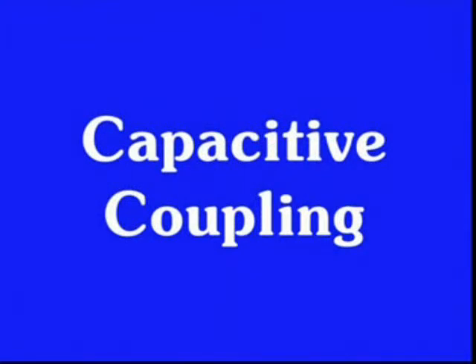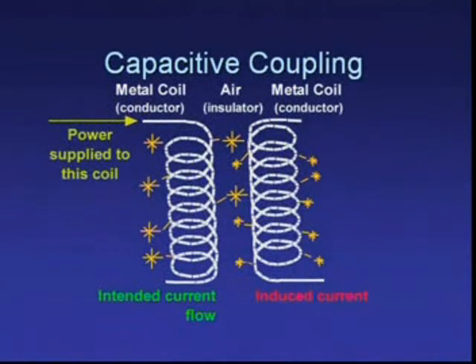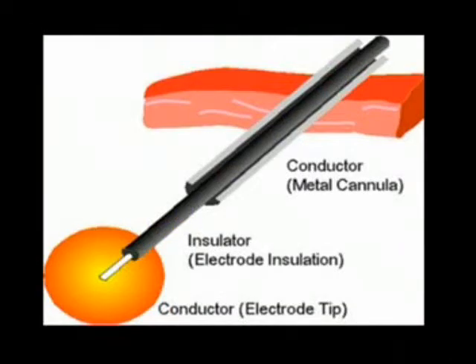Capacitive coupling. To understand this hazard, it is worth revisiting some basic physics and to remind yourself of what the definition of a capacitor is. A capacitor occurs whenever two conductors are separated by a non-conductor. As illustrated here, an electrostatic field is created between the two conductors, and, as a result, a current in one conductor can, through this electrostatic field, induce a current in the second conductor. The importance of this will become apparent when we consider how we can create an inadvertent capacitor by the composition and placement of surgical instruments.